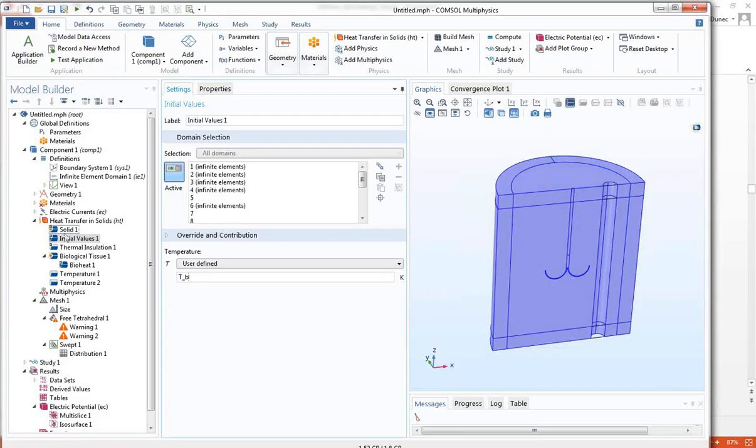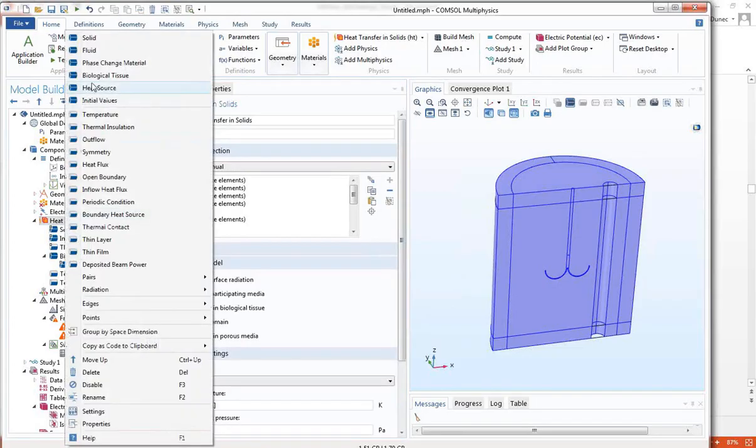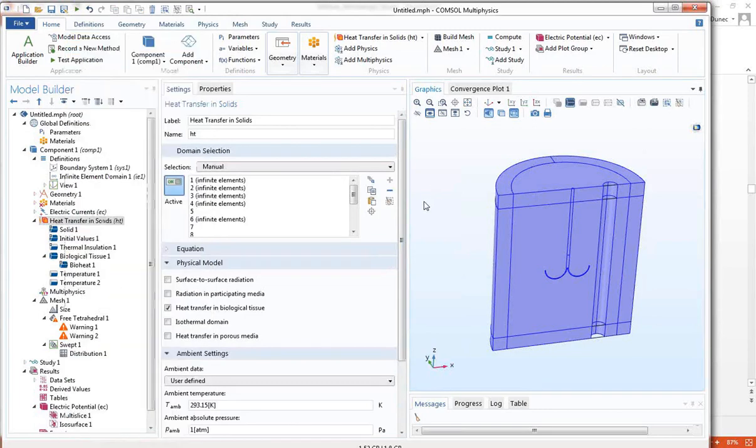Okay. I could always go in and say right-click and put in yet another initial value and then set the catheter at whatever initial temperature I wanted to. In fact, I could actually do a separate analysis to see, it's been in the tissue this long, what temperature is this thing? So this is where COMSOL really shines. So now we've got a heat transfer all set up. Let me check my cheat sheet to make sure I've got everything that I was intending to. Oh, I've got to change the material properties.